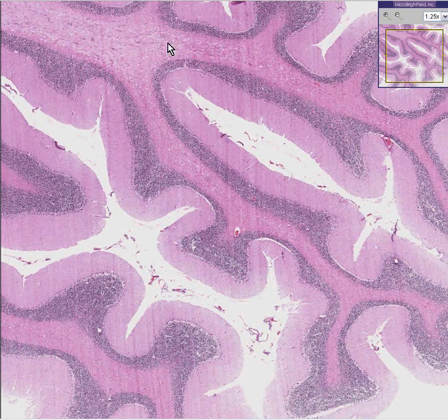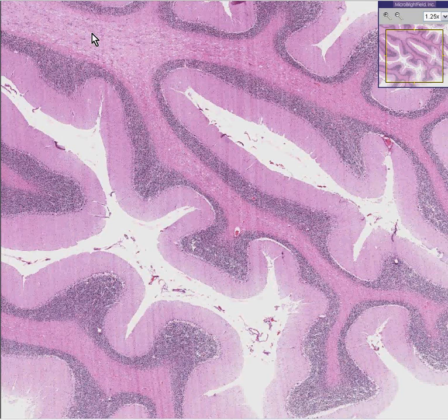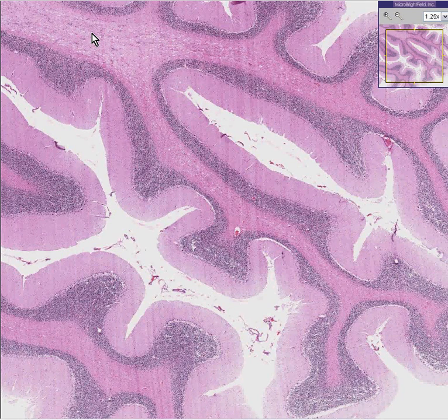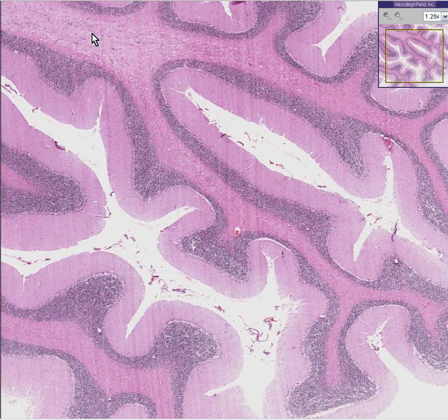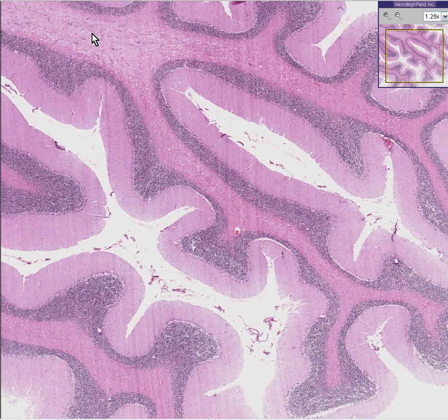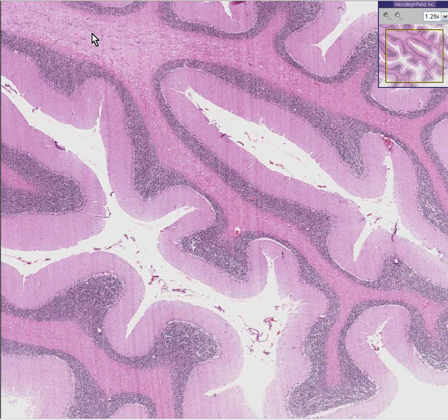In the spinal cord, it's the other way around. The white matter or myelinated ascending and descending tracks are on the outside, and the gray matter dorsal and ventral horns are on the inside.